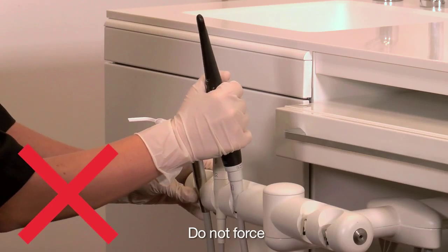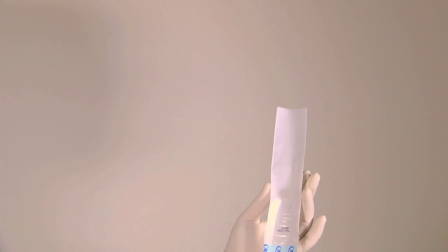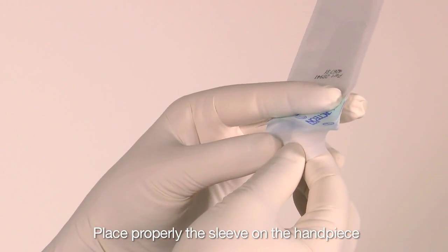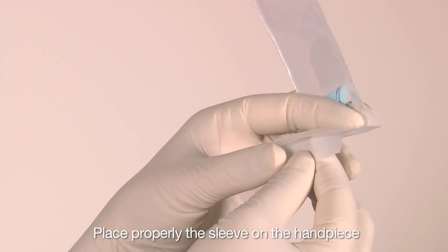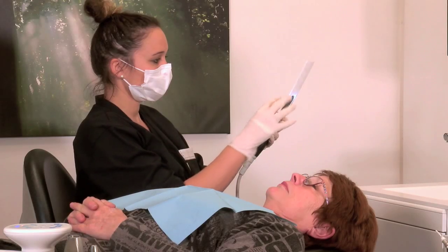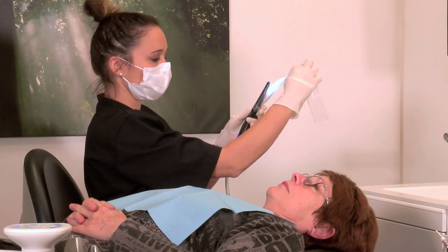Do not take the camera handpiece out sideways. Make sure the camera and the sleeve are positioned properly before placing the sleeve on the camera handpiece. Insert the camera handpiece in the sheath. Remove the first and the last outer wrapper.